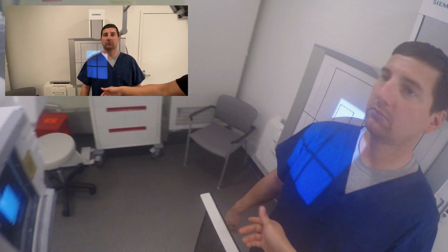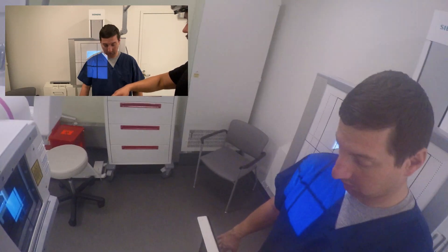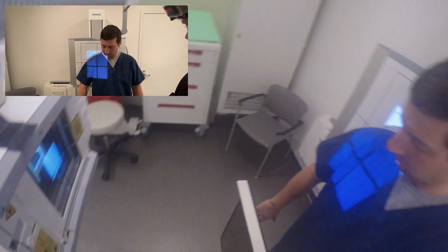So go ahead and rotate your palm backwards. There you go. And I'm going to rotate your palm forward, okay? I'll tell you to rotate your palm forward. Go ahead and rotate it backwards for now. Just like so. Yep. Good.